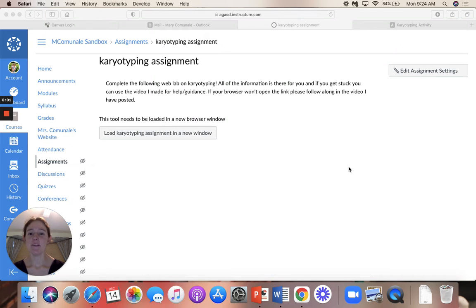Alrighty guys, today we're going to do a karyotyping assignment. So if you go into the assignment tab, it says complete the following web lab on karyotyping. All the information is there for you, and if you get stuck, you can use the video, which I'm making now, for help and guidance. If your browser won't open the link, please follow along with this video, and you'll be able to get all your answers that way as well, because I'm actually going to go through the lab step by step.